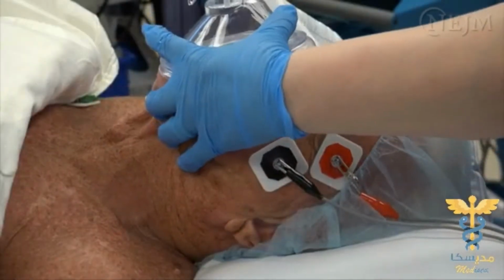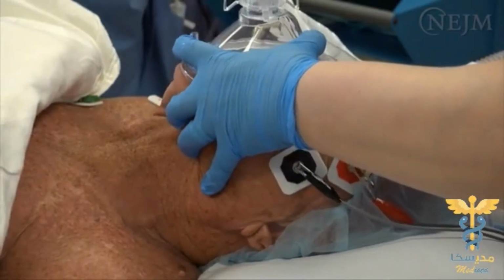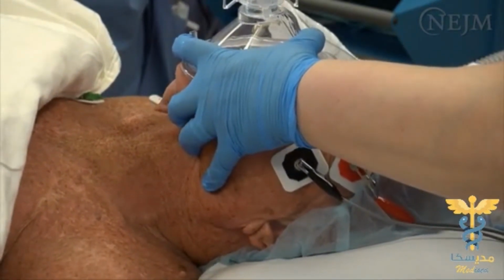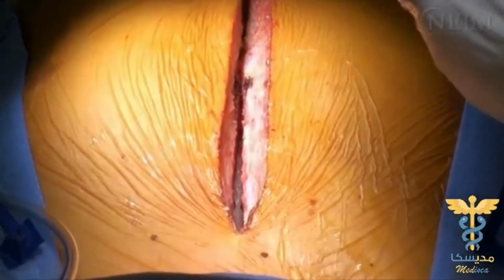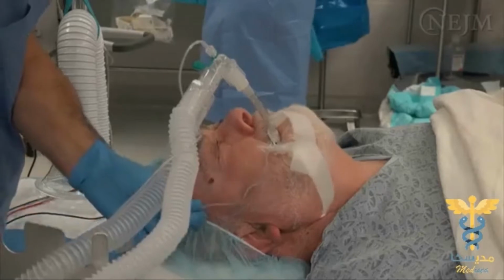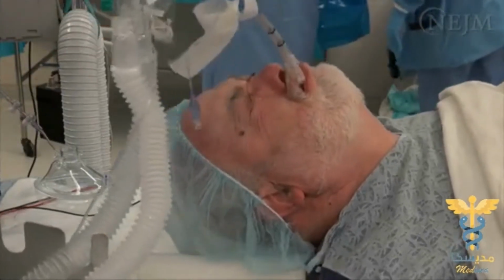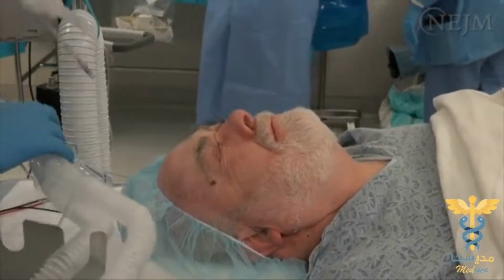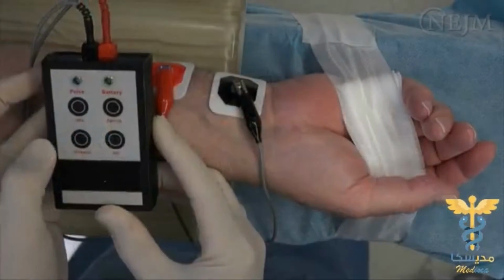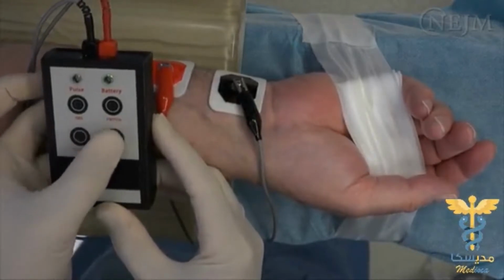Assessment of neuromuscular block during airway instrumentation can preclude complications such as failure to ventilate, airway trauma, regurgitation and aspiration, and optimizes intraoperative surgical conditions. Confirming the return of adequate neuromuscular function is also important prior to endotracheal extubation to ensure that the patient has adequate muscle strength and avoid hypoxemia. Thus, monitoring neuromuscular function before, during, and after the administration of neuromuscular blocking agents is vital to patient safety.